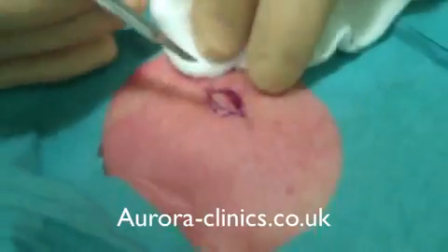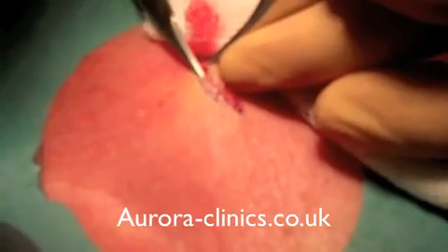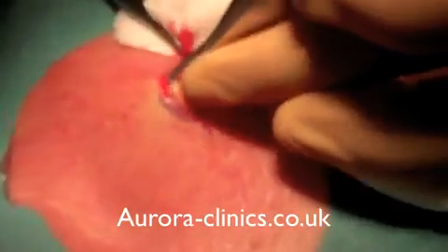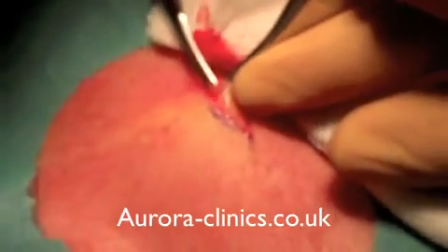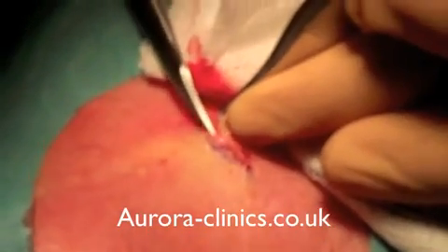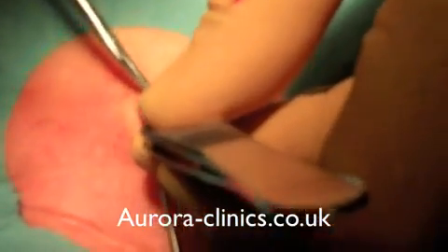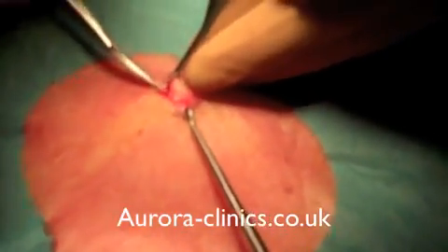I cut through the skin initially, and then gently with my pointed tenotomy scissors, which have a fine end, I dissect downwards by a mixture of spreading and cutting onto the wall of the cyst. On a fresh cyst, this is much easier. You basically cut down until you see the white glistening surface, spread onto that plane, and cut any material above that. Then you should be able to work gently around and get the cyst out.